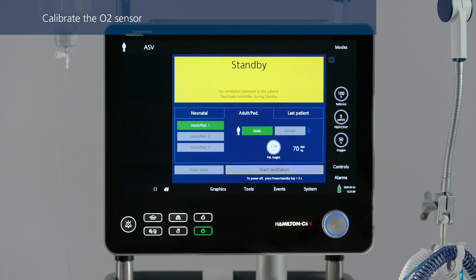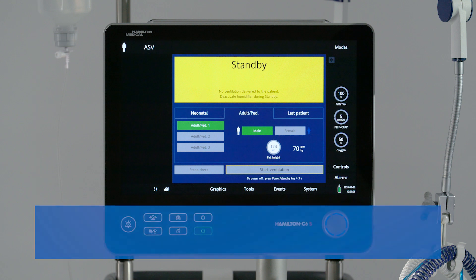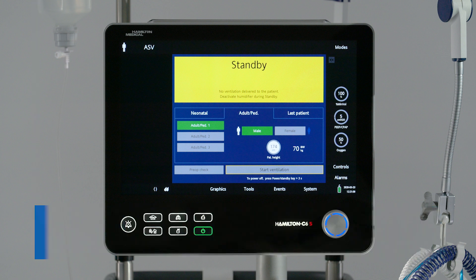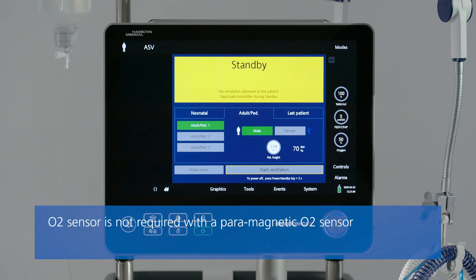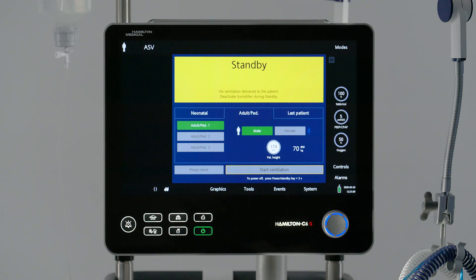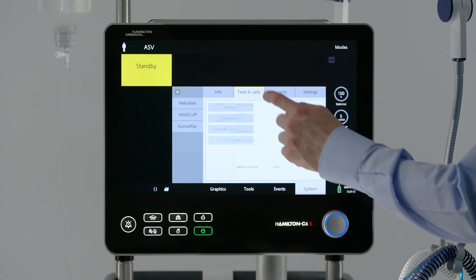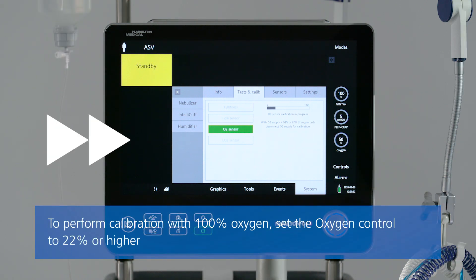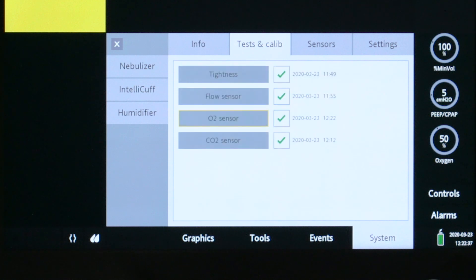Calibration of the oxygen sensor is only needed after installing a new galvanic oxygen sensor or when a related alarm occurs. The calibration procedure can either be performed when the ventilator is in standby or during active ventilation. To perform calibration with 100% oxygen, set the oxygen control to 22% or higher. The gas source has to be connected. When calibration is complete, make sure there is a green check mark in the O2 sensor checkbox.